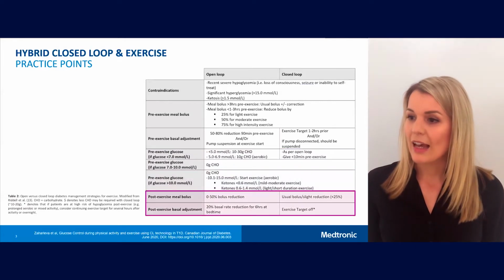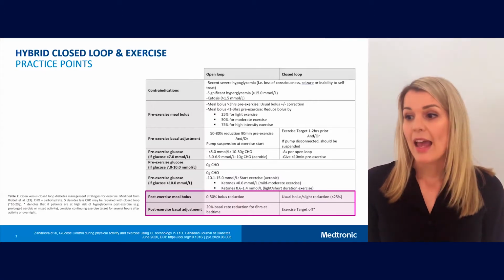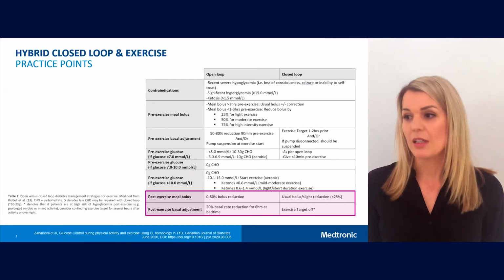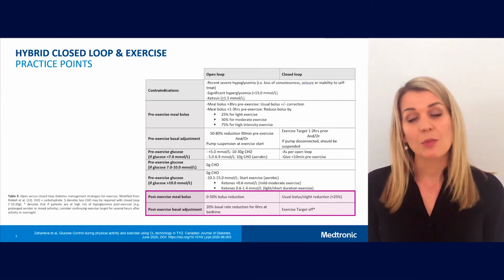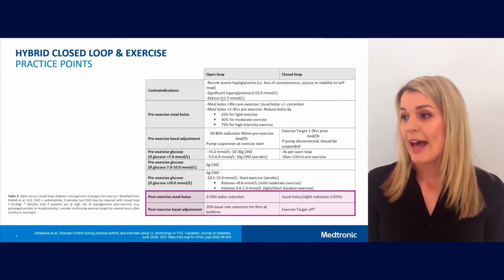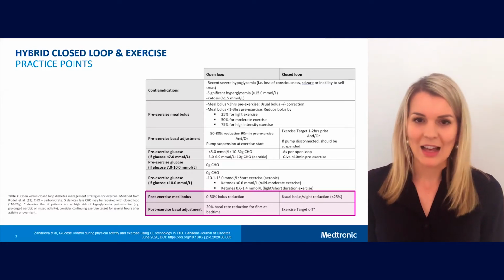For post-exercise insulin adjustment, a reduction may be needed for bolus in open loop, and for post-exercise basal adjustment, a 20% reduction, especially for afternoon activity for delayed hypoglycemia. In hybrid closed loop, a reduction may not be necessary given the adaptive nature of the algorithm, but of course if someone has had hypoglycemia in auto mode after exercise, then a temp target can be set.